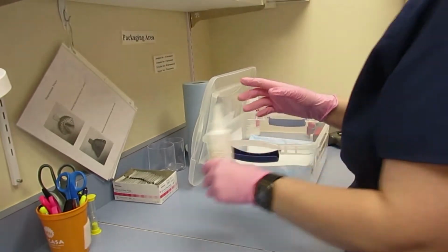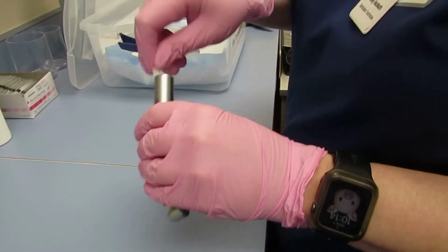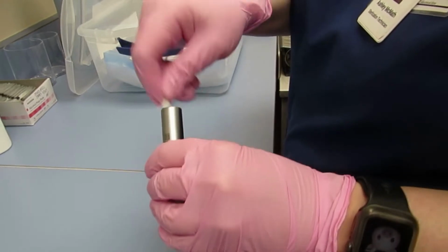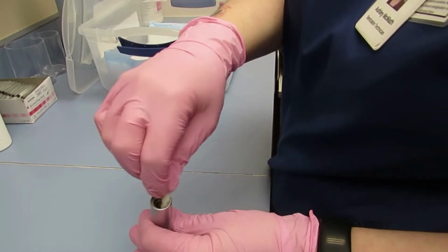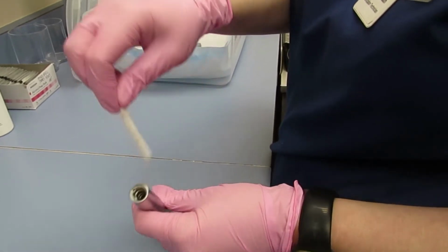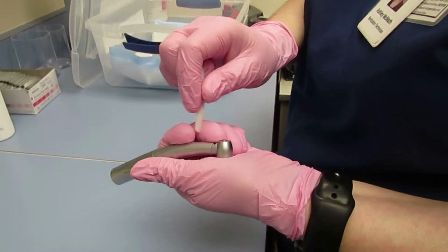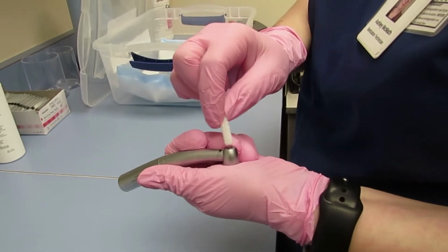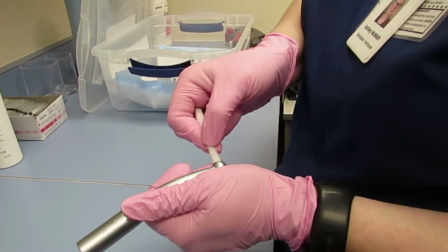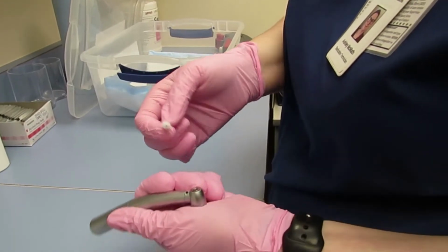We have transferred all the handpieces to the autoclave room. After purging all the handpieces, we are going to insert a medical grade pipe cleaner into the back end, or connecting end, and to the chuck. By inserting the pipe cleaner, we will be removing any lubricant left behind.